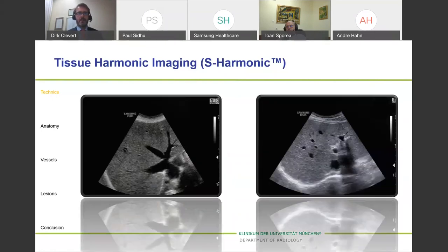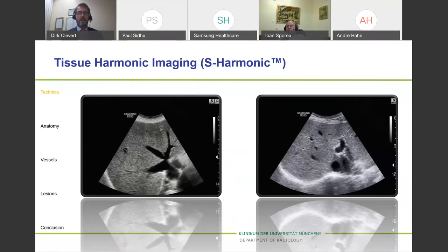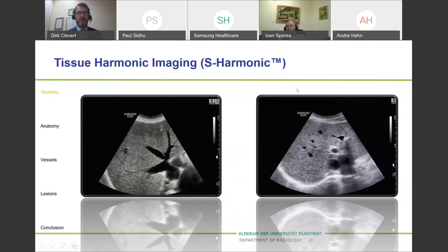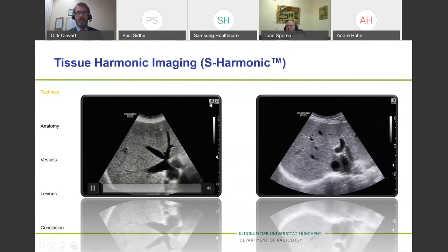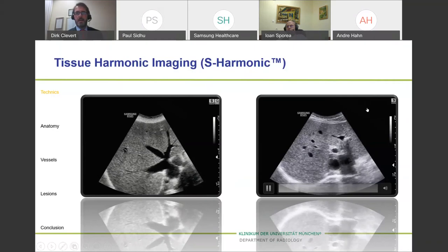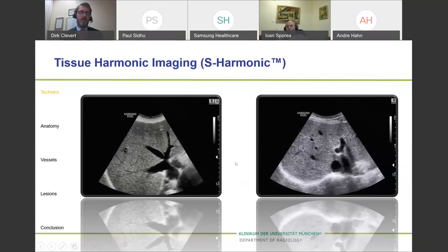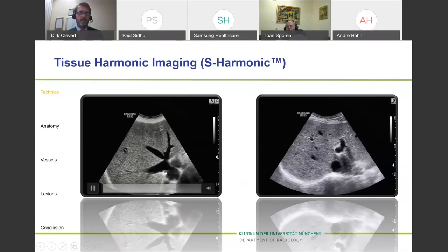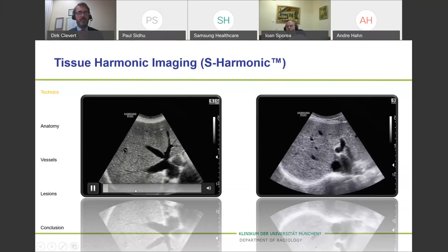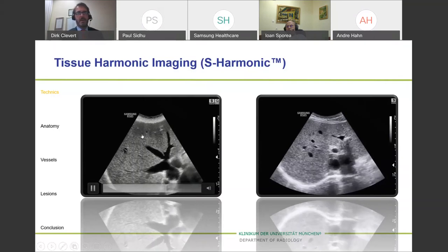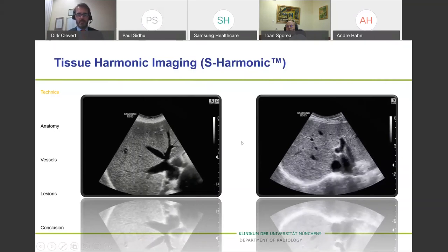Now with harmonic switched on — you can see it indicated there — the vessels become darker, you see better borders, you get better penetration. On the near field, you also get a higher resolution.